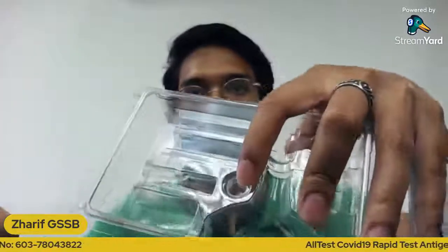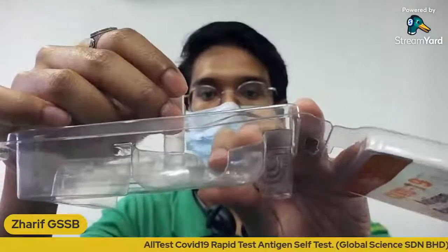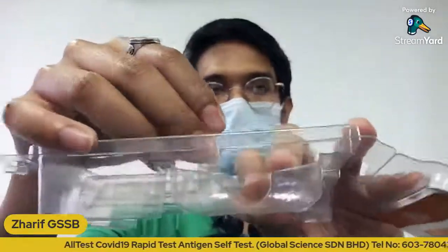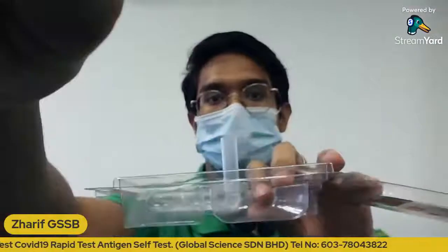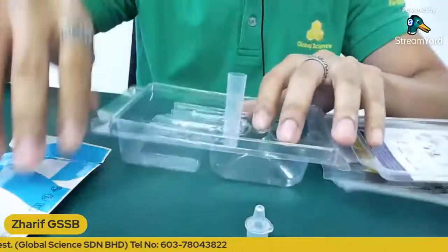If you notice on the package, there's an indentation for you to place your tube so it doesn't fall over and spill. So, like that. Put it like this.